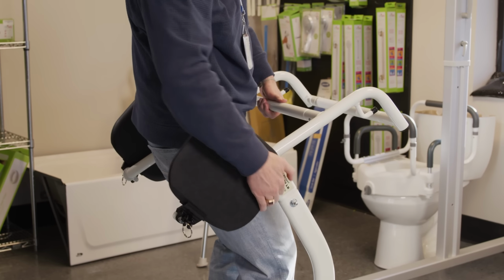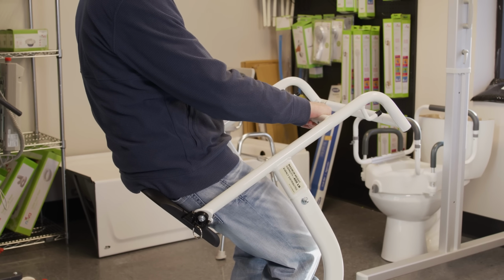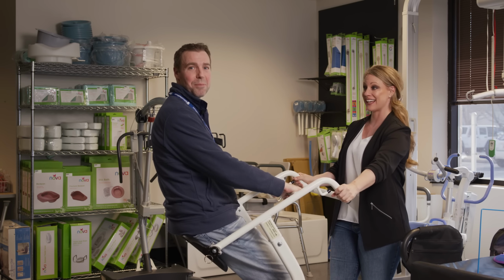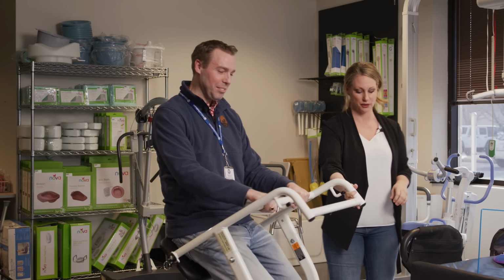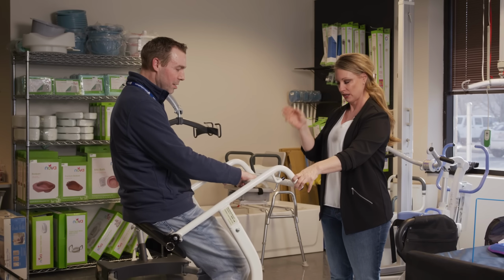You want to slide these paddles down behind them, and then the person is going to sit down. Giving them a break, but moving whomever. Have you ever actually ridden in one of these? This is my first time riding in one, yeah. Okay, so as you can see, it's easy for the person to move, anybody of tall height even, to get around.